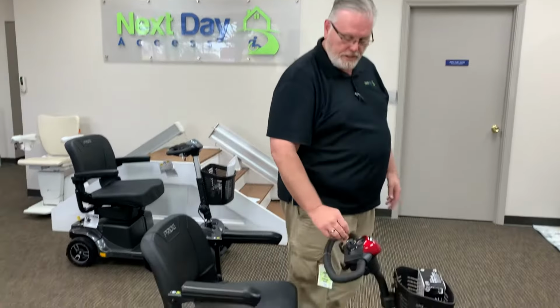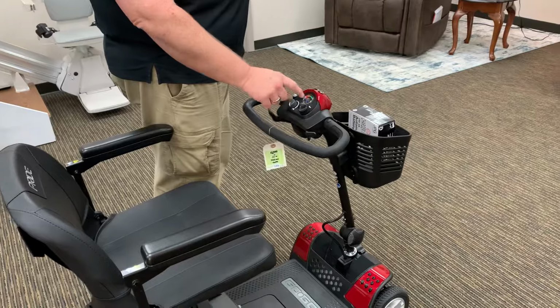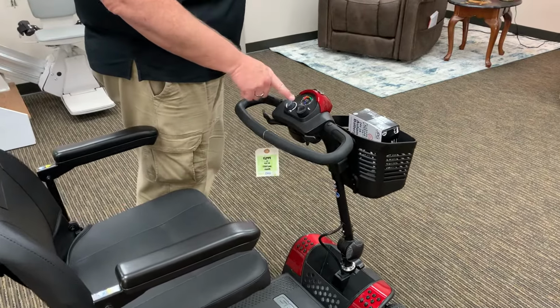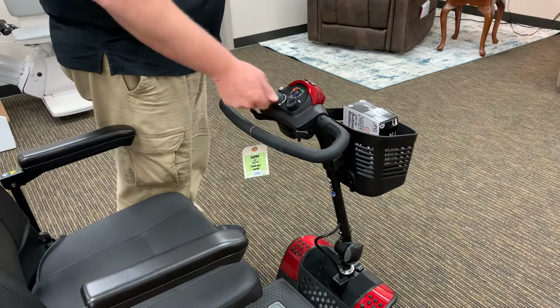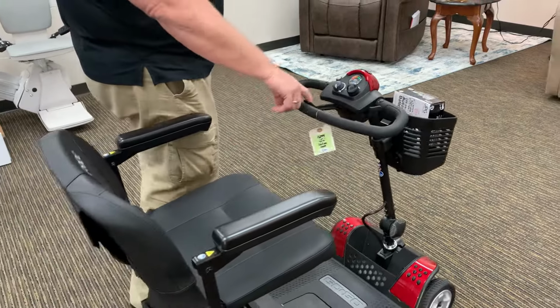Now right here is the dashboard. This is the key. When it's turned on, your indicator full and empty is right there. It shows you how much battery life you have. You have the tortoise and the hare, the speed, that should be self-explanatory. A little horn, then you have your throttle, takes you forward and backwards.